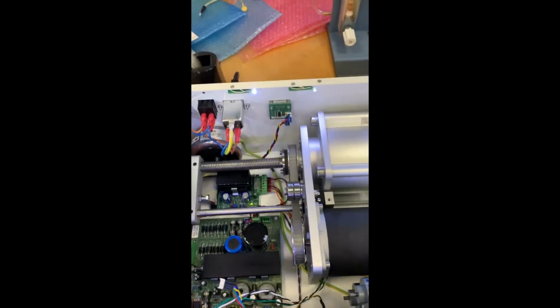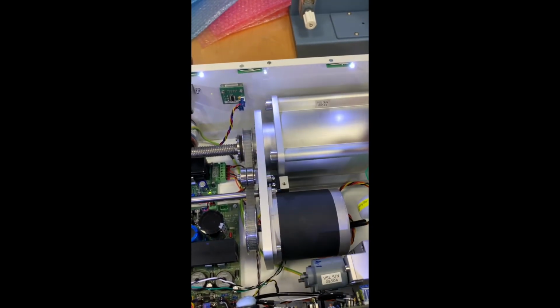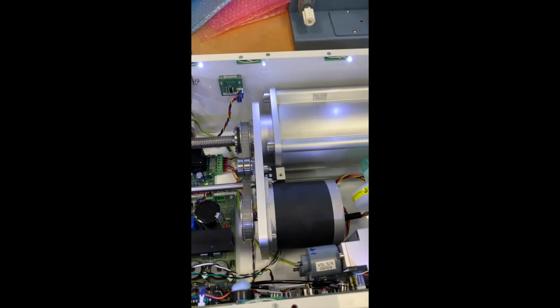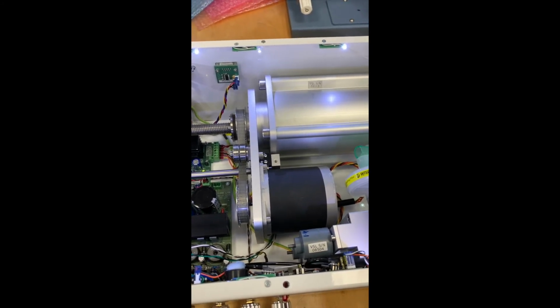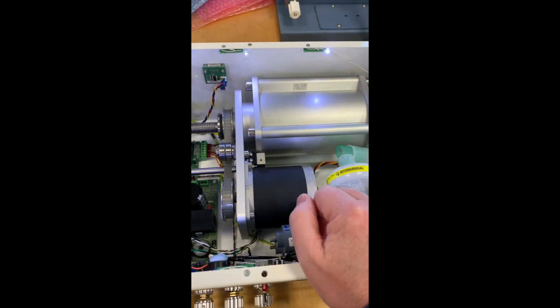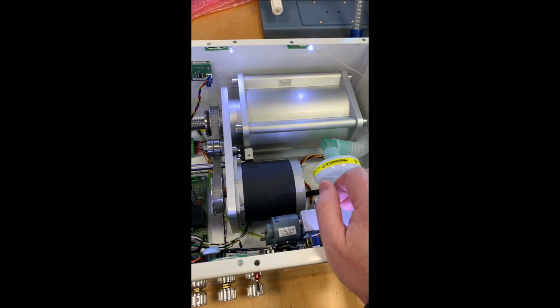All the patient driving pressure is created by this pump, which is a big piston inside this cylinder acting like a big syringe. There's no need for a separate driving pressure. There's no requirement for an oxygen high pressure line to drive this ventilator. The motor here drives the pump, and the valves here control the airflow of gas to the patient.